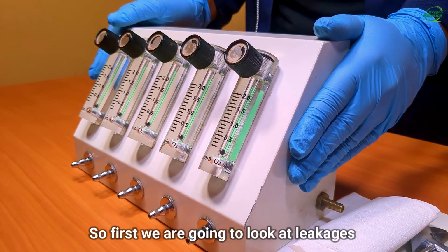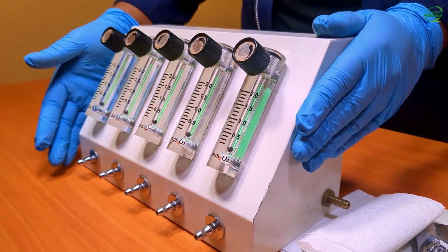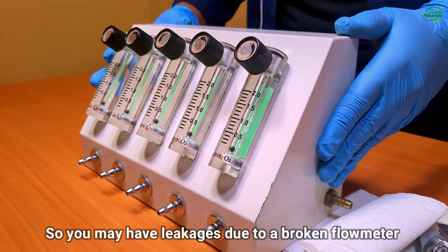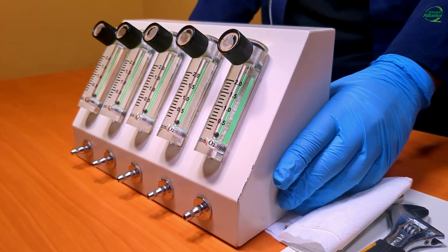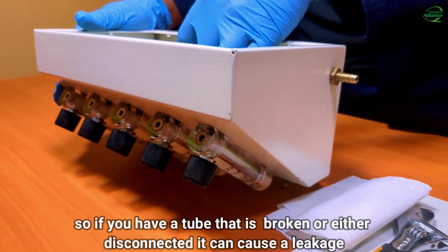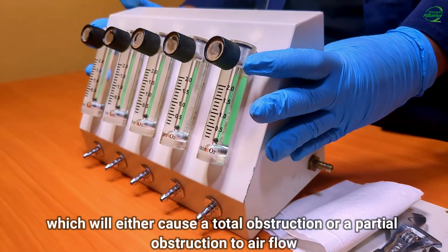So first we're going to look at leakages. If you have a leakage within your system, it could cause either no air to come out or less air to come out. So you may have leakages due to a broken flow meter or due to a broken tubing. If you have a tube that is broken or disconnected, it can cause a leakage, which will either cause a total obstruction or a partial obstruction to your airflow.